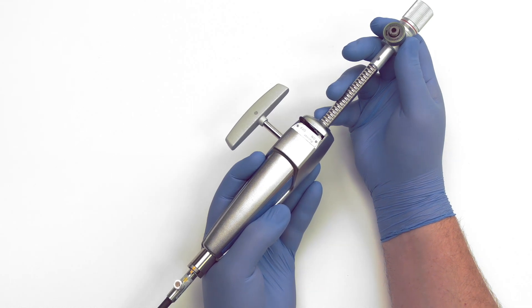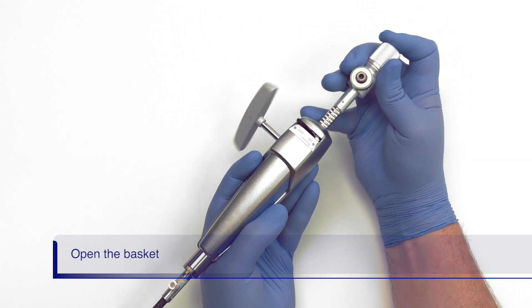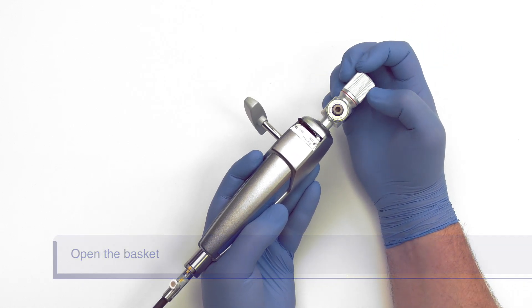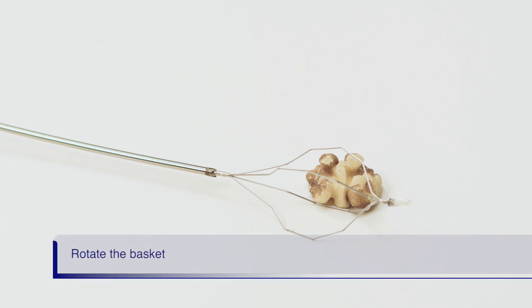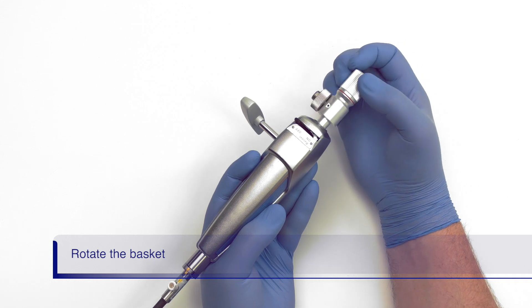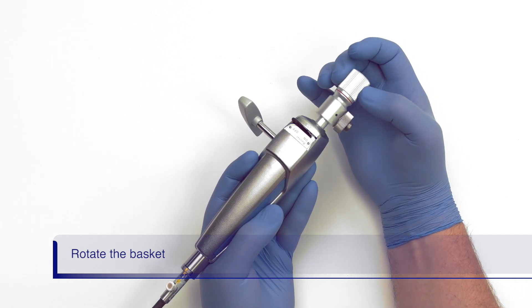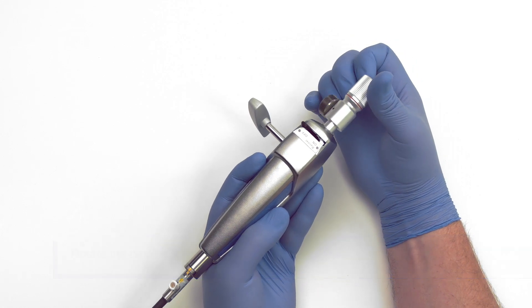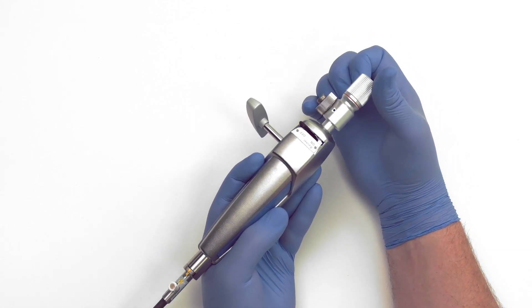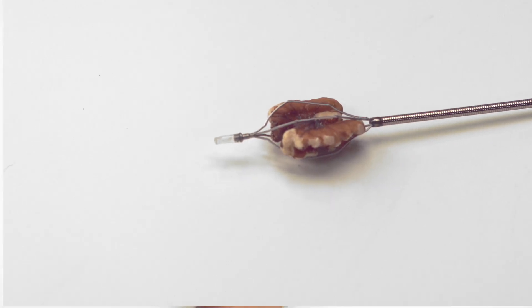After completing the intraductal exchange, open the basket by advancing the rod on the handle forward until the basket is fully deployed. Rotating the basket may help to acquire the stone. The basket is rotated by turning the rod on the back of the handle in either the clockwise or counter-clockwise direction. Once you start rotating the basket, you cannot change direction. Once the stone is captured in the basket, you may begin crushing.